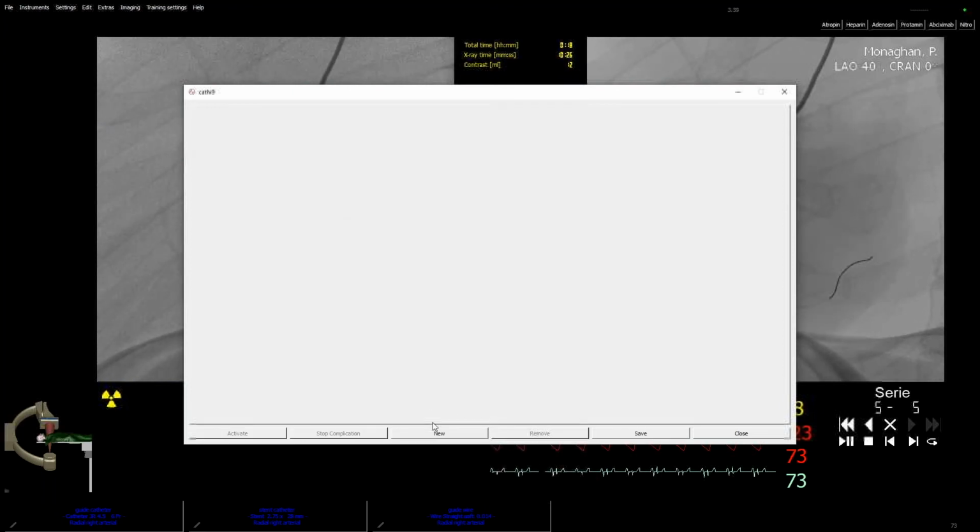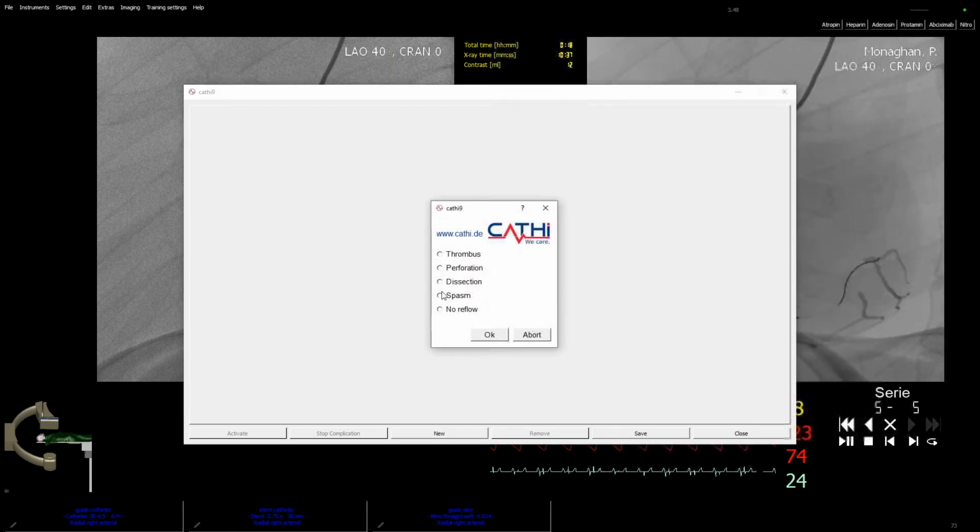Hi, this is Manuela speaking. We have prepared several complications that you can feed into the running simulation, such as a perforation, a dissection, an embolization, and many more. Hussam will send out the complications after the meeting to interested people. Click on new. The types of complications you can add are thrombus, perforation, dissection of the artery, spasm, and no reflow.